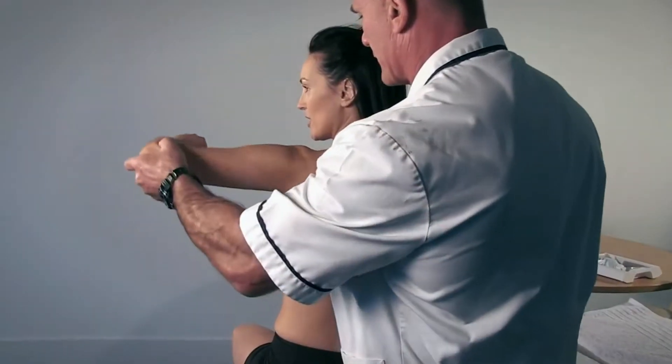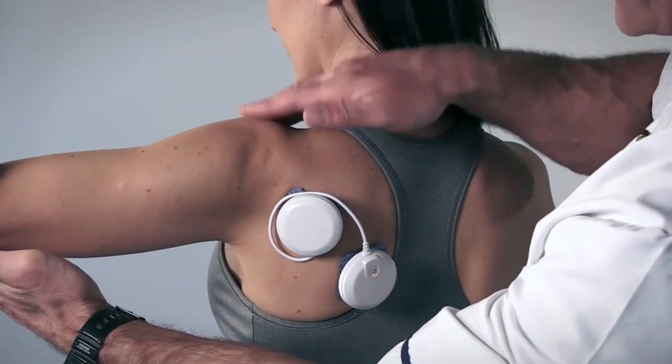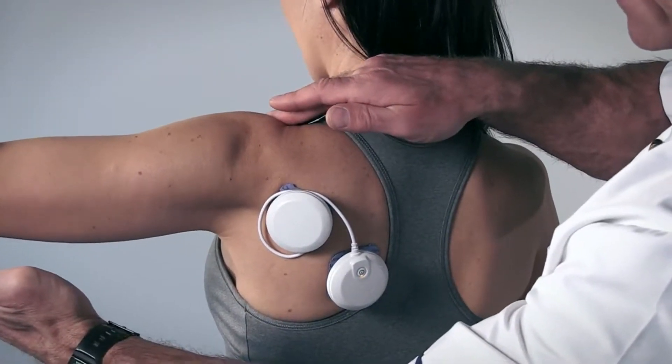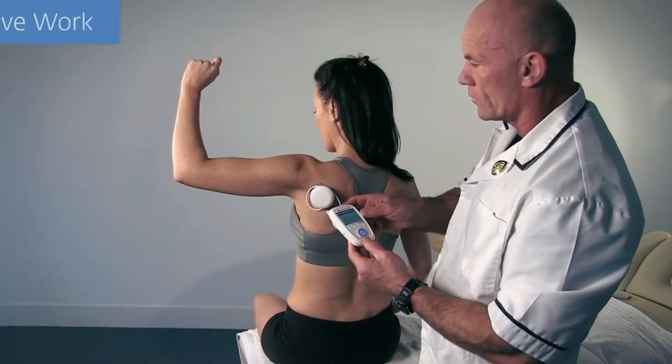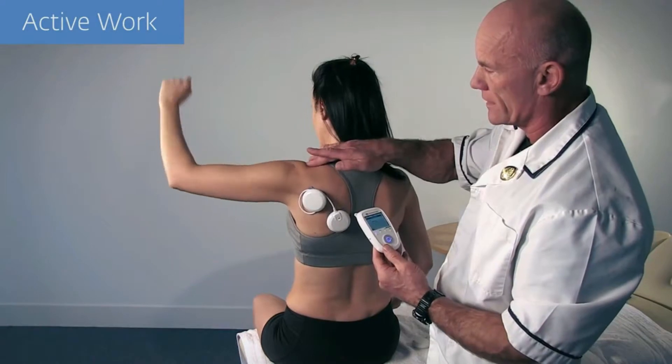Progression can be made by altering the arm's position and introducing active work while ensuring correct glenohumeral joint and scapular positioning. Active work can be progressed by combining physiological movements and further challenging the scapular stabilizers.